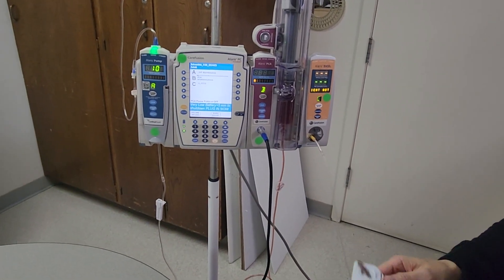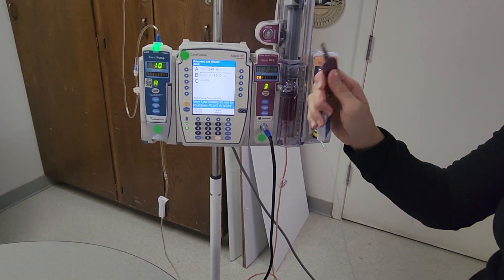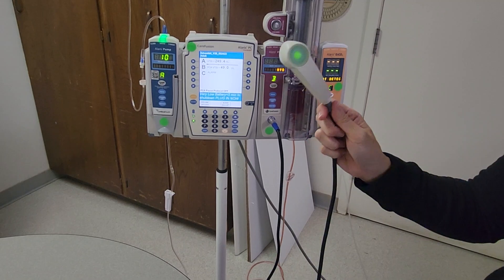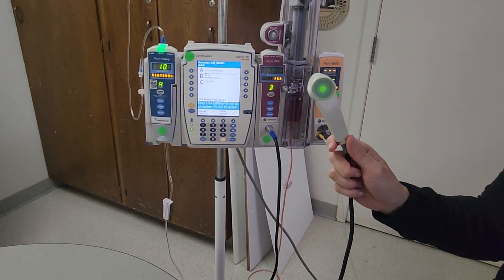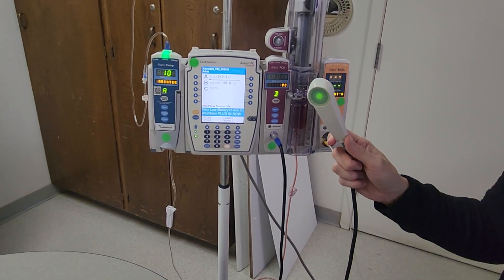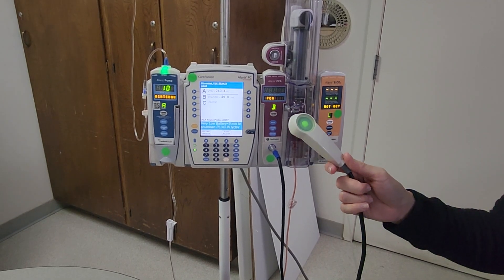Before you leave the room, make sure you have secured the PCA key and replaced it in the Pixis machine. Also make sure the PCA patient-control button is in the patient's reach and that they are able to use it. Be sure to follow all hospital policies and procedures related to PCA, as those policies are updated from time to time, and make sure to obtain and document your vital signs per policy.